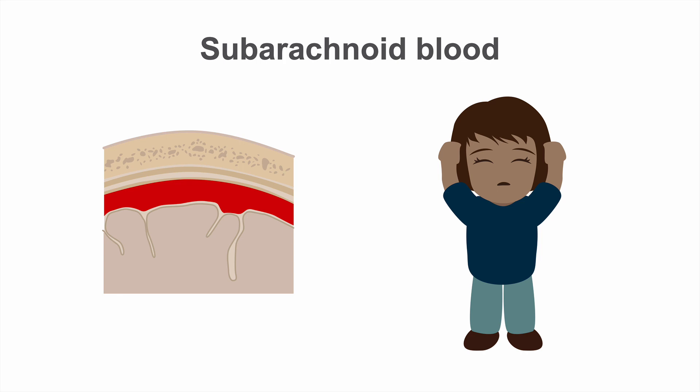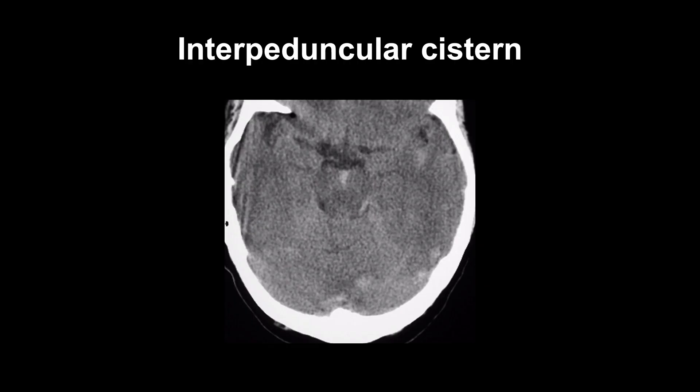When subarachnoid hemorrhage is suspected as the cause of headaches, a good place to begin your search on CT is the interpeduncular cistern. This space is at the level of the midbrain and, as its name indicates, it lies between the two cerebral peduncles. This space is normally filled with low attenuation cerebrospinal fluid, so when the triangular cistern is visible because it's white, that means it's filled with blood.